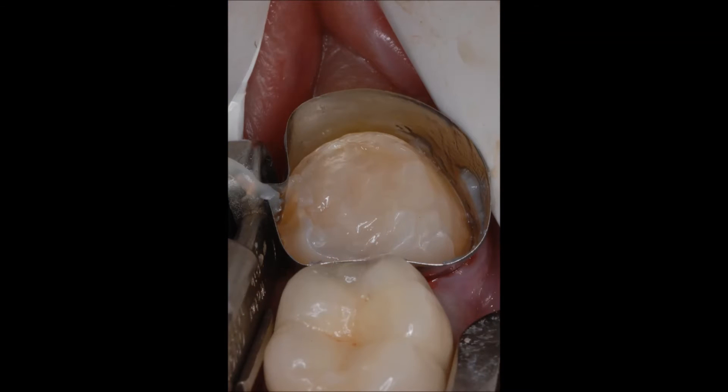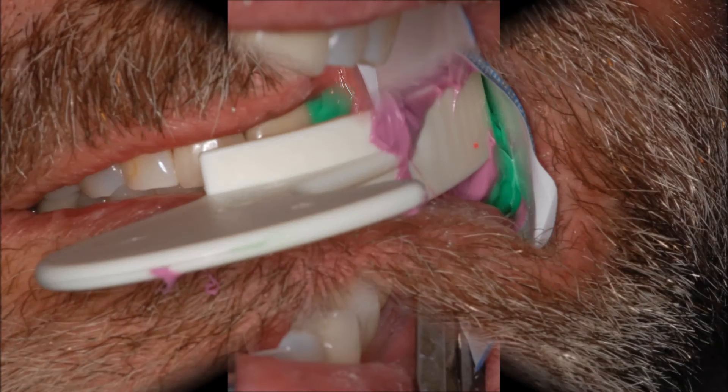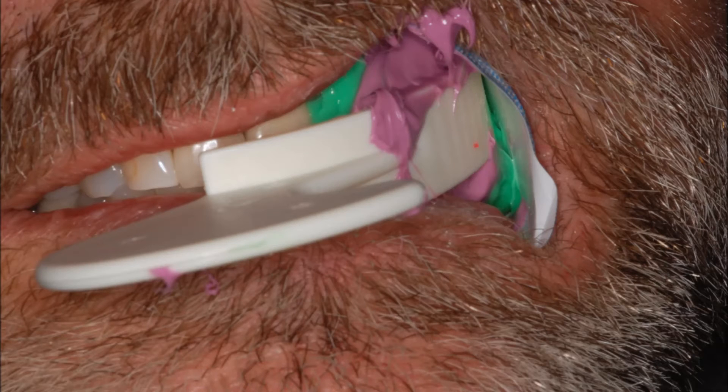Core buildup bonded into prep. Ground prep ready for impression. Excellent isolation is provided by the threesome combination of the saliva ejector, the neo-drys, and the greater curve matrix.